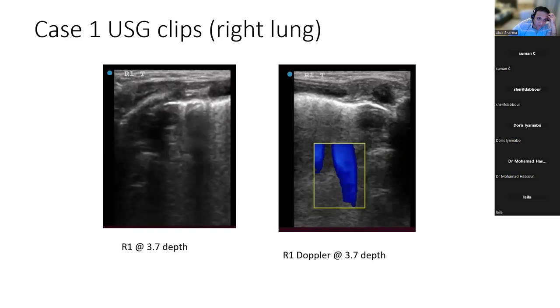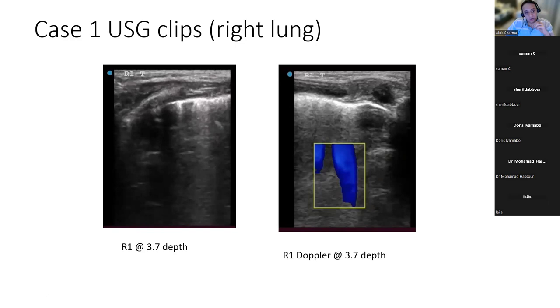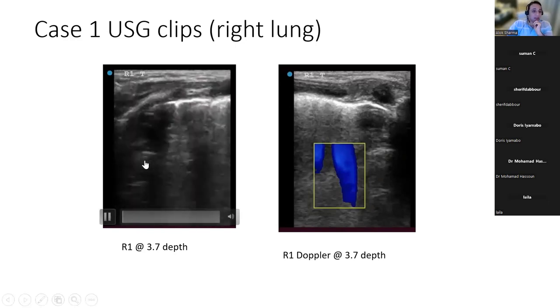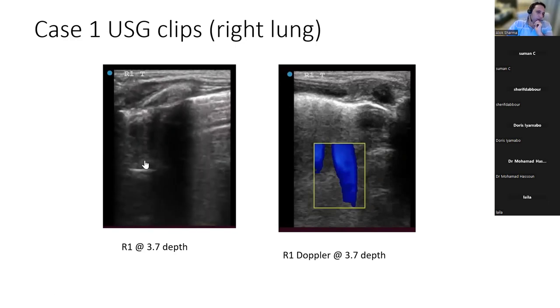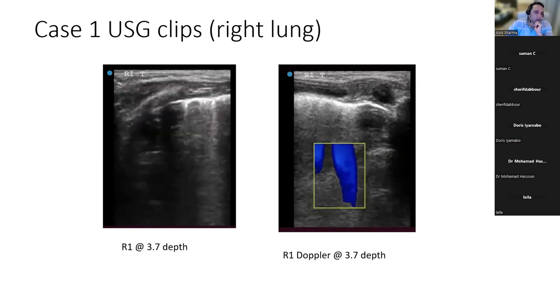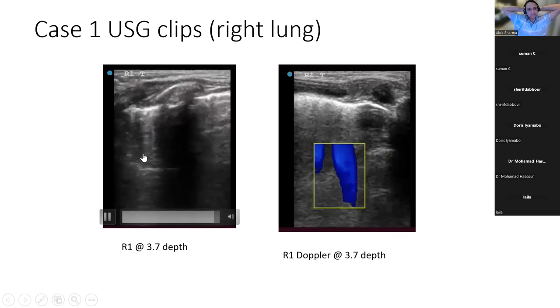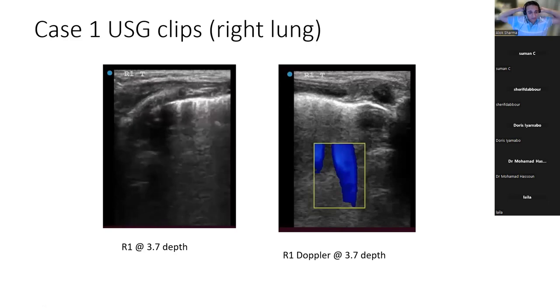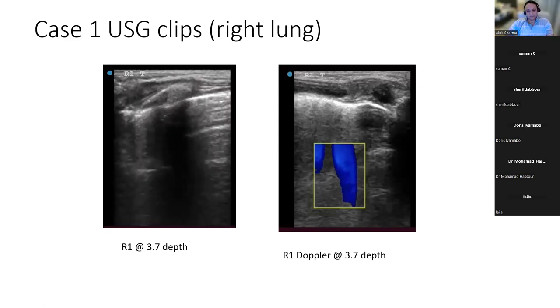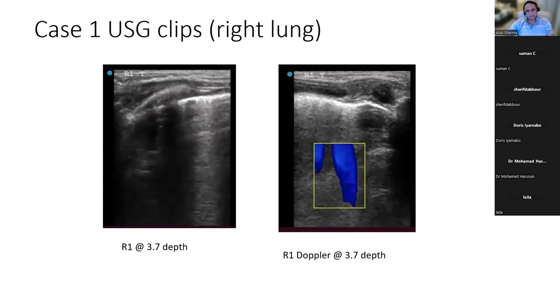And then again, you see a pleural line that comes up with sliding. Do you remember I told you about a B dash profile where you can't see the pleura? And again, for me, the question is whether you've got a right upper lobe collapse consolidation. So you've got consolidation, but you've got atelectasis along with it. I can't see thymus in this view at all. I varied the depth here. I used a lower depth just to look more closely.